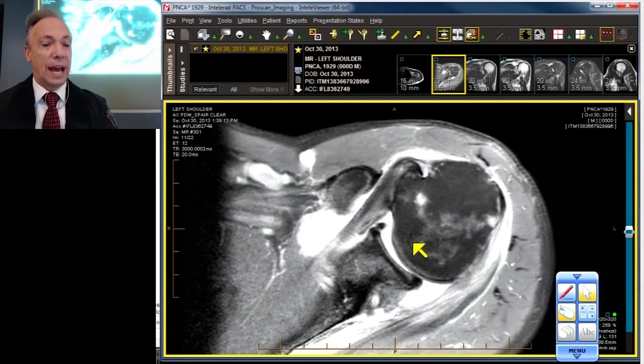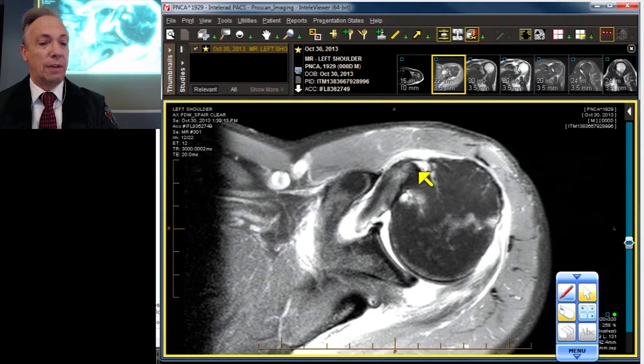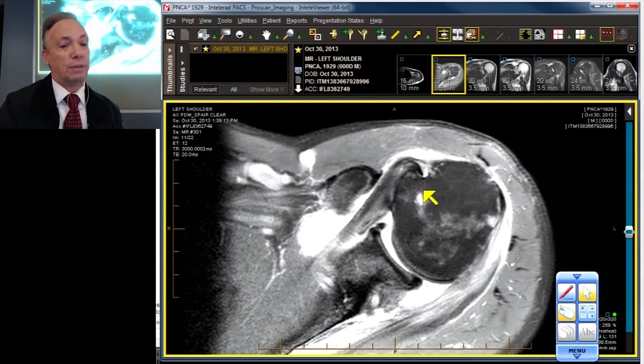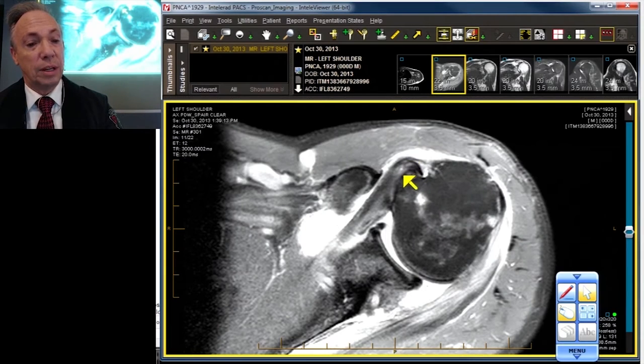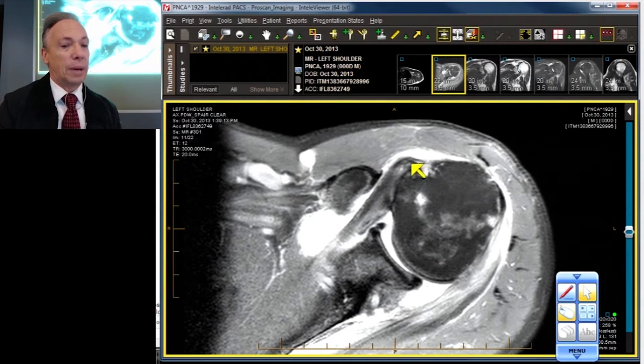Let's keep working our way down, and as we do we run into the rest of the biceps. Let's follow it with our scroll. It never comes back to the proper location ever again. It always stays perched on the lesser tuberosity, because the fibers that normally keep it in — namely the subscapularis fibers and the transverse humeral ligament, which is formed mostly by the already-torn coracohumeral ligament — are gone, allowing the biceps to displace into the loving arms of the subscapularis.